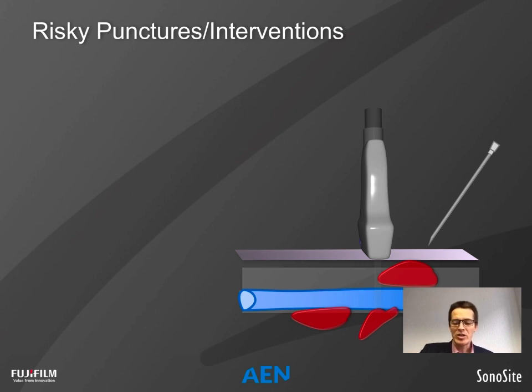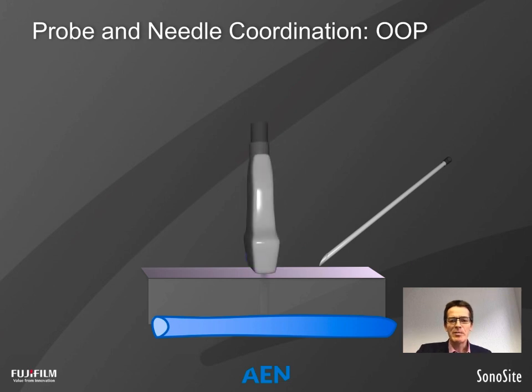So ultrasound as such doesn't really improve anything. So in this case, there was no needle tip control. So remember, never lose your needle tip. And for this, we need methods how to actually achieve this. Let's go over some basic probe handling methods.